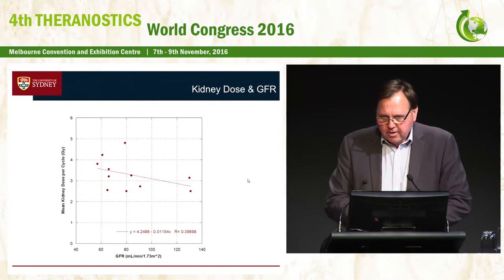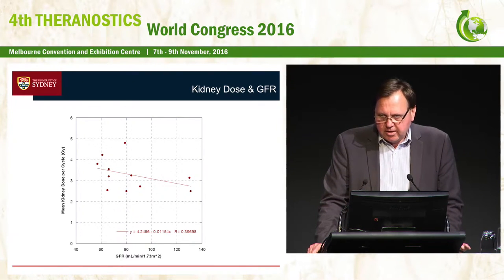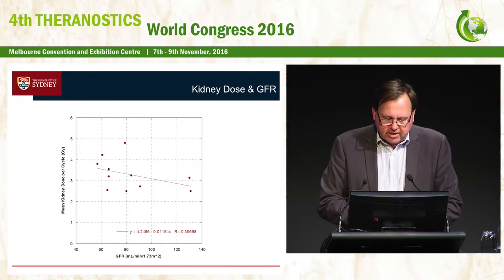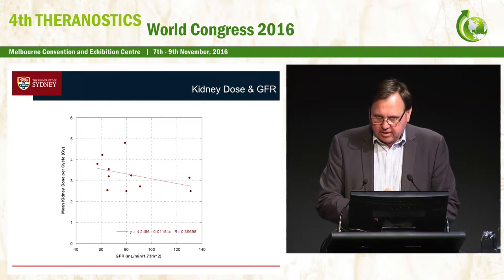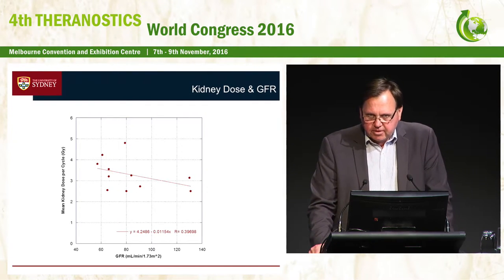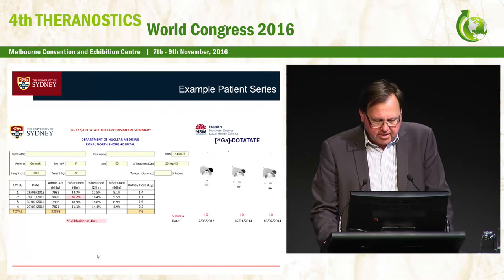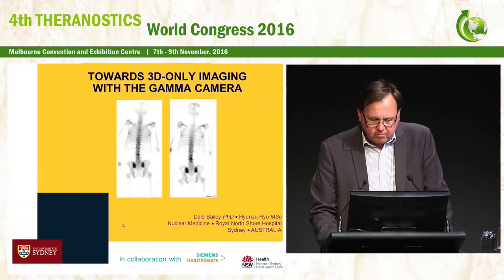We've also noticed what Joel Matthew was referring to, that it seems that those patients who do get a higher kidney dose calculated from these measurements generally have a lower GFR, and we're now looking at this in a larger series. These are not corrected for organ mass at the moment, and I think it's going to get even tighter when we do that. So it's a message that when you see variability in the doses for different patients, have a look at their renal function, because that might be the clue as to why you're seeing that. And we produce a standard output showing the kidney dose per cycle, the amount administered, and certain retentions. So then we know if we can treat again.